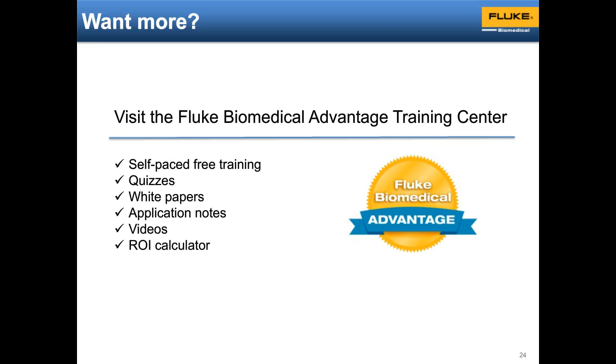Great. And what do you do about testing LED wavelength accuracy? So there are some testers on the market that will do that. We typically don't need to. You're basically just testing the R curve to determine if the device is still functioning to specifications.